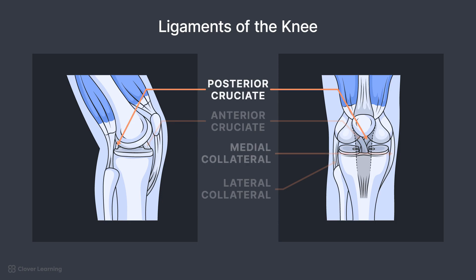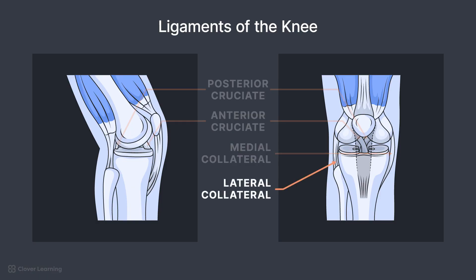The medial collateral, or MCL, runs along the medial or inner side of the knee and protects from forces pushing the knee inward. The lateral collateral, or LCL, runs along the lateral or outer side of the knee and protects from forces that push the knee outward.